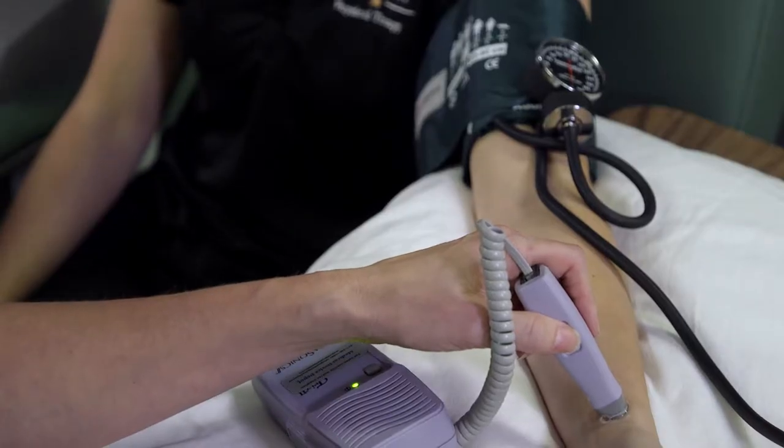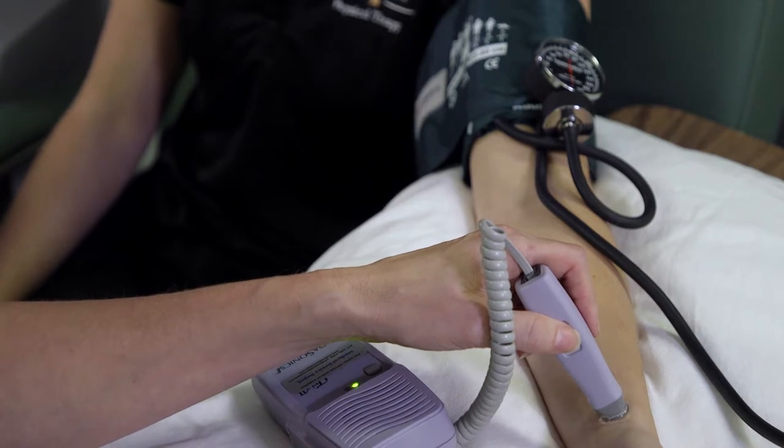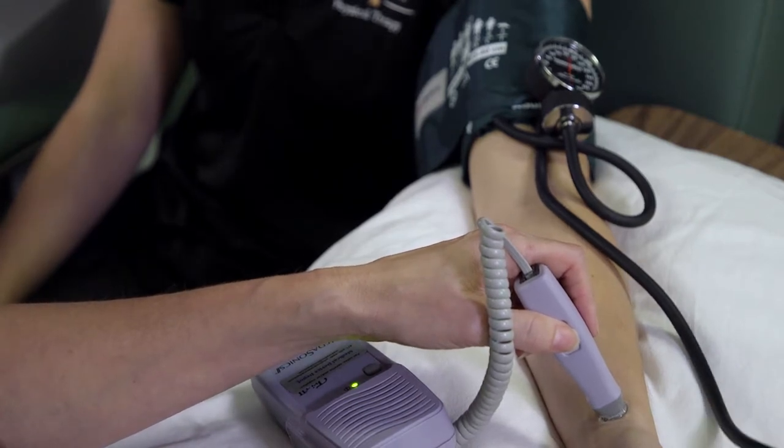Listen carefully as the Doppler detects the point at which the pulse disappears during blood pressure cuff inflation.